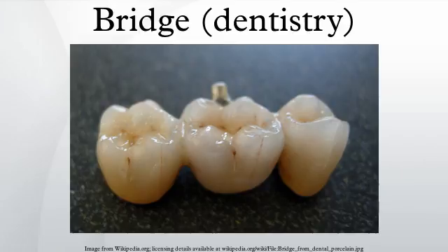The root surface area of the abutment teeth has to equal or surpass that of the teeth being replaced with pontics. The materials used for the bridges include gold, porcelain fused to metal, or in the correct situation porcelain alone. The amount and type of reduction done to the abutment teeth varies slightly with the different materials used. The recipient of such a bridge must be careful to clean well under this prosthesis.